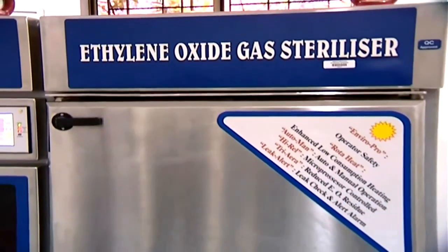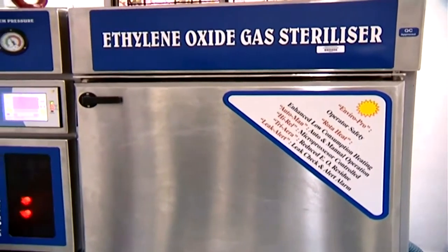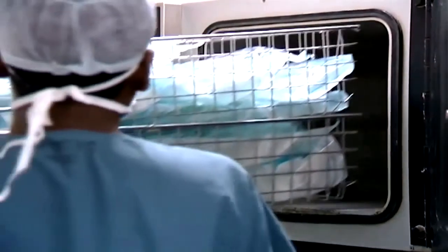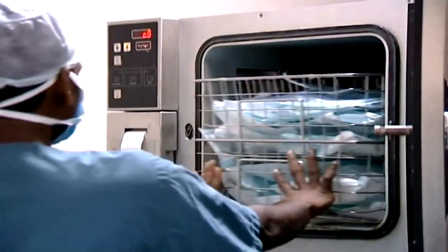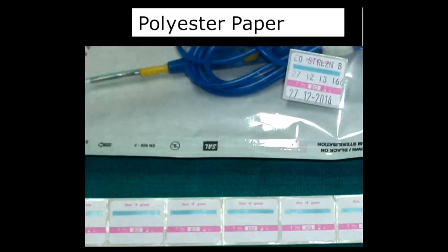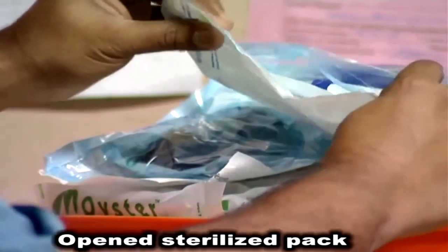ETO is a good option, but it's a very toxic gas. And maybe in another 4 or 5 years, it's going to be banned worldwide. So what is going to take over will be your plasma sterilizer. Here you can see the packs being loaded in the ETO sterilizer. And these are the indicators for the ETO sterilizer. Different indicators. Any pack after ETO which is open is not sterile. Should not be used and discarded.